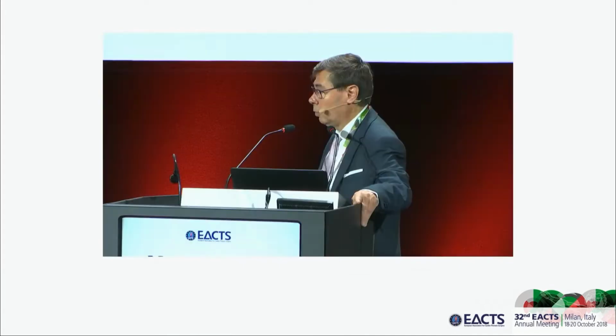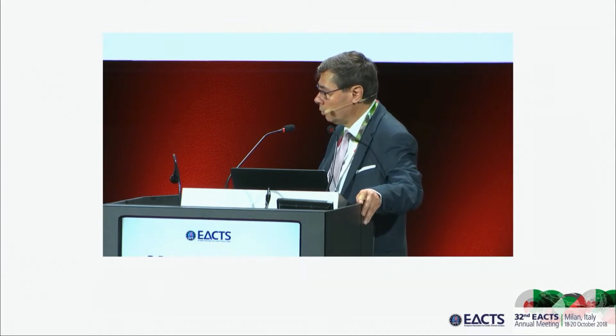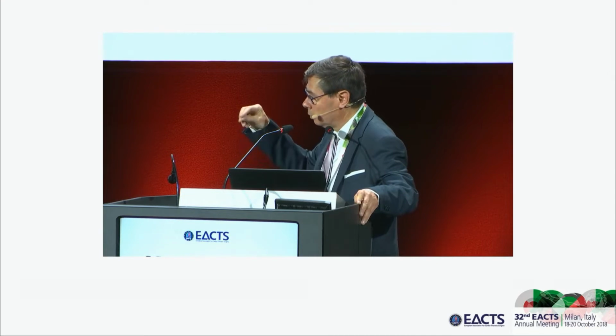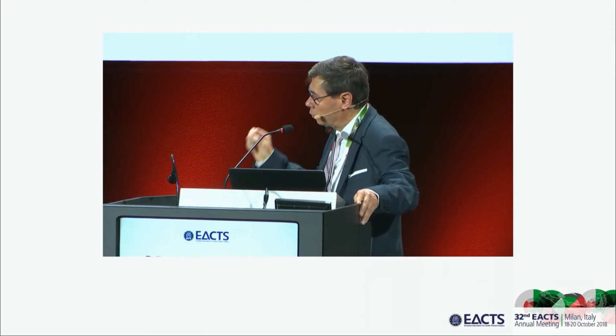Yes, sometimes we had cases where, because the coaptation length was not long enough, we went back on pump. Sometimes we have a billowing of the valve without any aortic insufficiency, and we see that the effective height is too low, then we go back on pump in order to heighten this coaptation by adding a small plication at the free margin, so even if there is no AI. So billowing per se is an indication to increase the level of coaptation more?